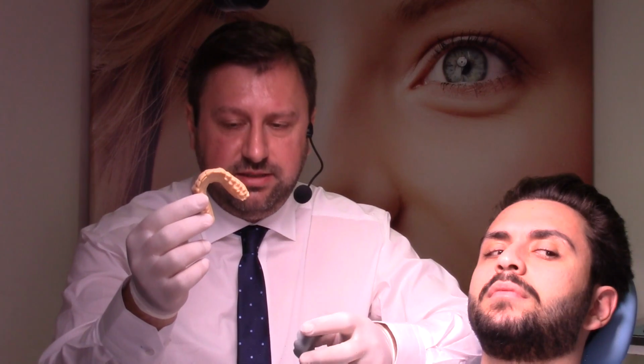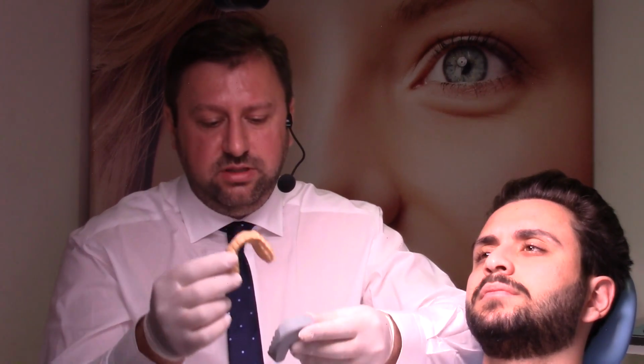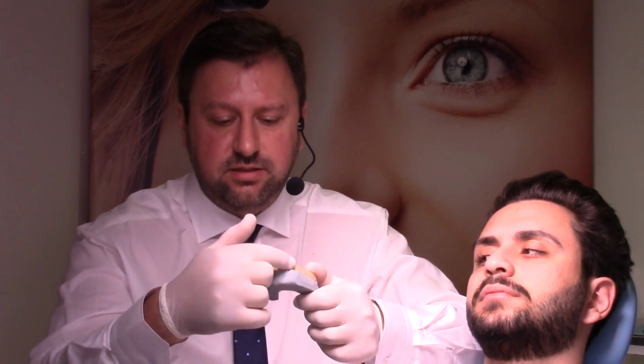Okay, so now you'll continue to show us how will be the best mock-up for this patient by doing a mock-up with a composite, with a bisacryl composite. Yes, exactly. Over this printed model, we did a silicone index. We cut it according to the gingival level of the teeth, as you see. We will try it in the patient's mouth.